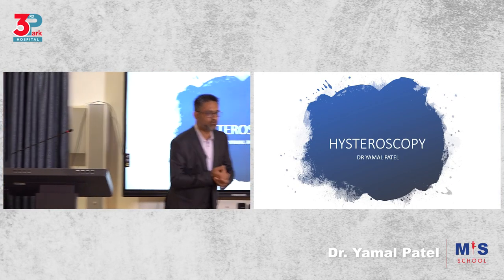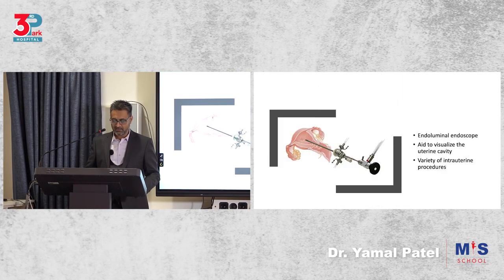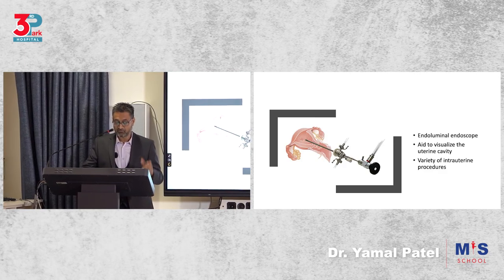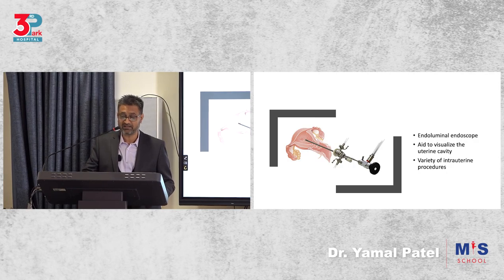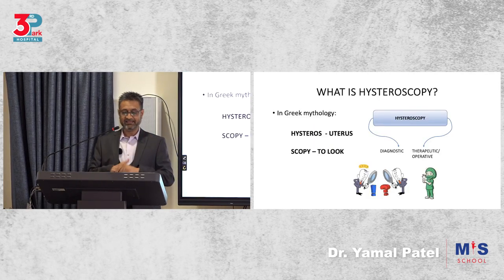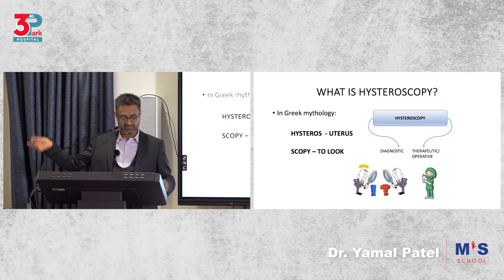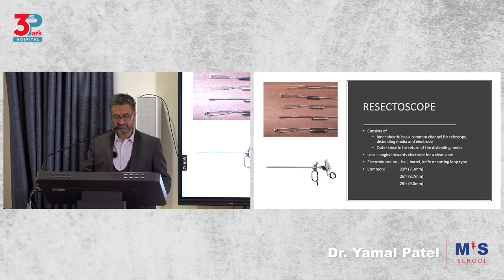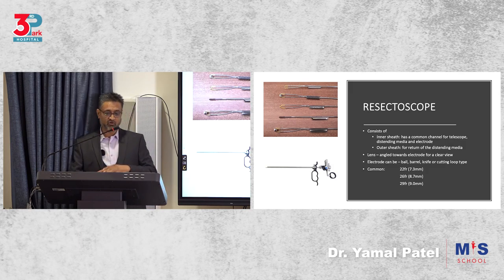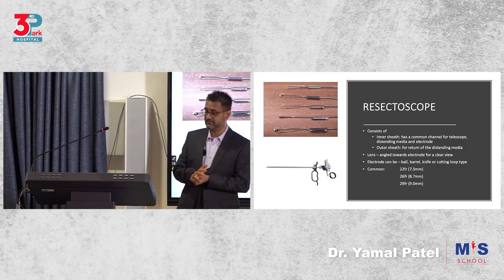Did we discuss hysteroscopy? So I can quickly give you some tips on hysteroscopy. It's an endoluminal endoscope to visualize the uterine cavity and can be used to do a variety of intrauterine procedures. It's from the words hystero and scopy, to look into the uterus, and can be used for diagnostic and therapeutic procedures. The instruments are the following, we've discussed these. Then we have the resectoscope, which is for more operative procedures using energy.